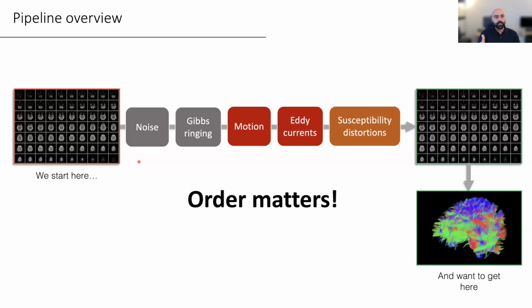That's common for the clinic because these kinds of fancy pipelines are not really applicable for most clinical things. So upsampling the image can help gain a bit more detail within a slice. And for examining anatomical structures, this could be helpful. But that means that the image or the signal was already acquired and interpolated or manipulated prior to us receiving the data.